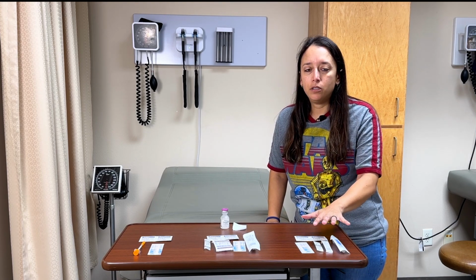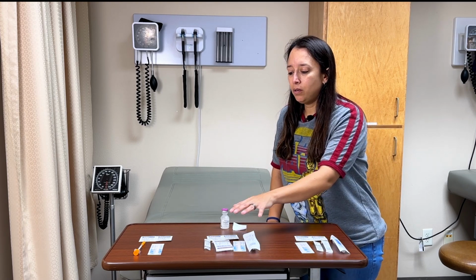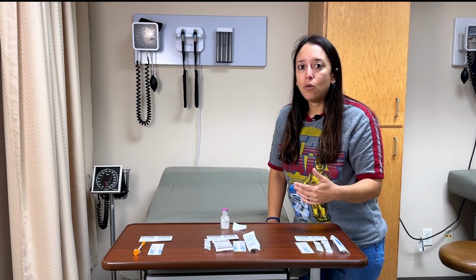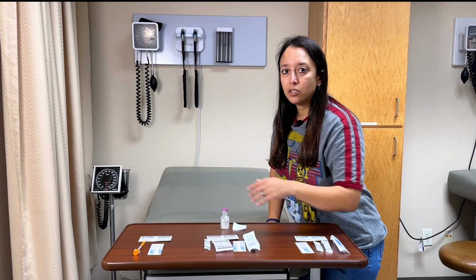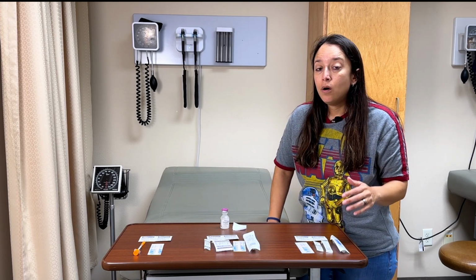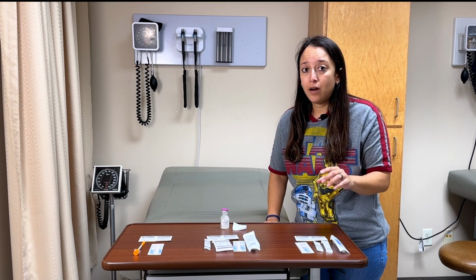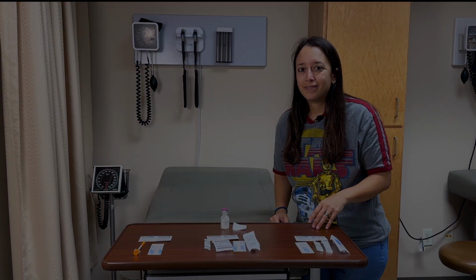We're going to walk you through how to do an intradermal injection, which would be like a TB test. We're going to walk you through how to do an intramuscular injection, like a vaccine or an antibiotic injection, and we're going to walk you through how to do a subcutaneous injection, like an insulin injection. We'll take you step by step and show you all the tips and tricks how to do that on a little simulator. So let's get started.